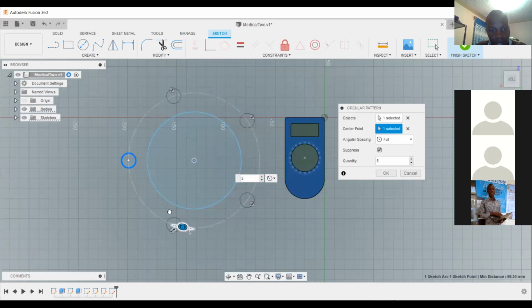Then you can increase them. You can increase the number by rotating like that. So when you rotate like that, you rotate that circle, you increase the number, or you just put there like 12.